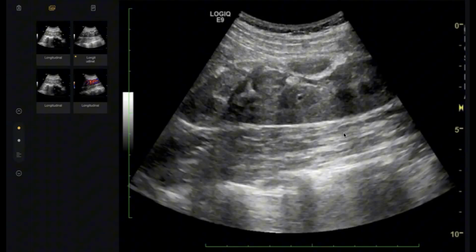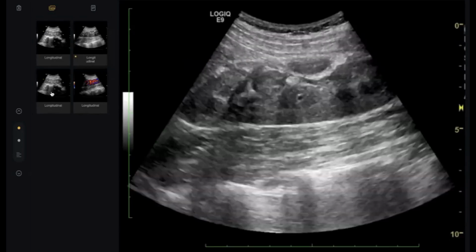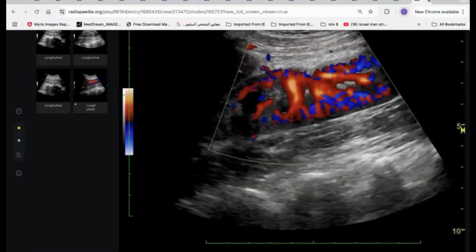So this case is for expectation, for guessing. The exam should be clearer than this, to be fair. But I want all of you to use all your skills and weapons to get the highest marks. Guessing is very important in the exam. Thank you, doctor, so much. It was crossed fused ectopia.